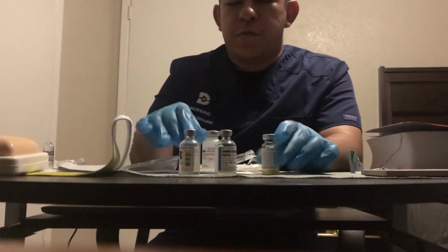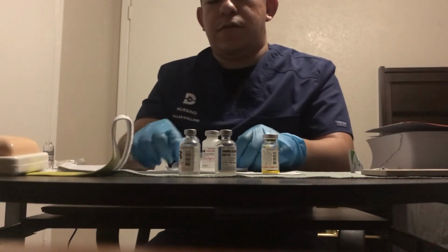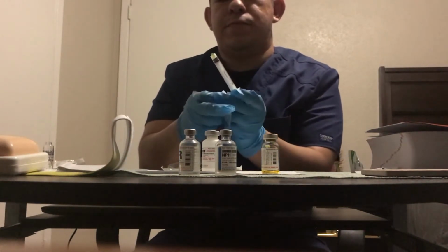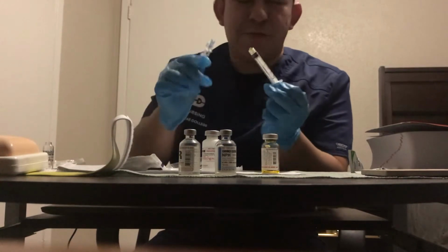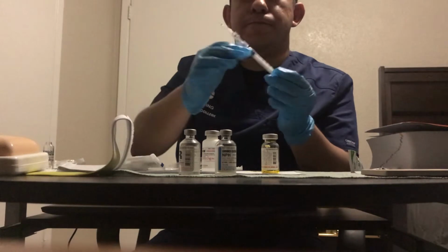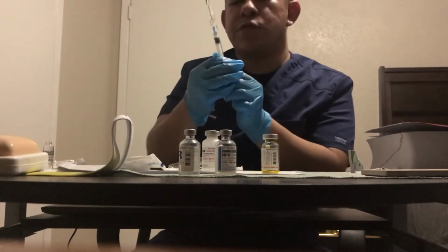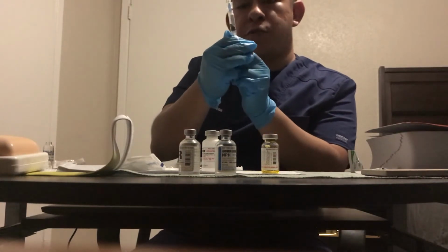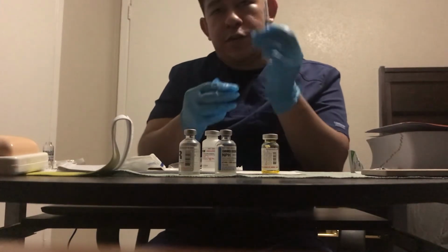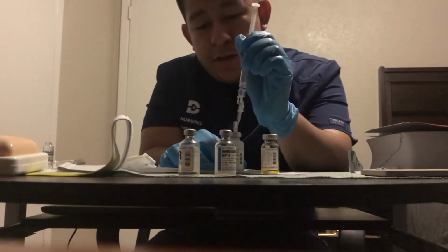And so we're going to open our syringe, open our needle, assuming that this is a new needle, and attach that. And then you would draw up, since we're getting 2.5 mLs of water, we're drawing up 2.5 mLs of air. And so I have my 2.5 mLs of air, and then I would just inject it.